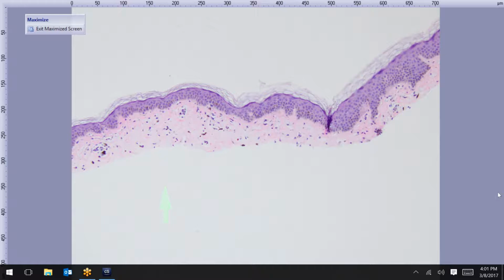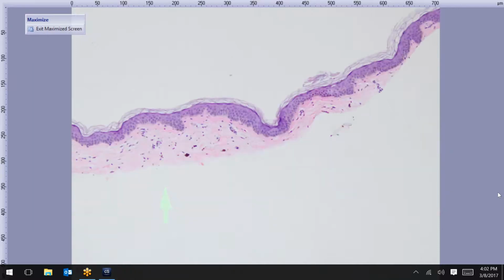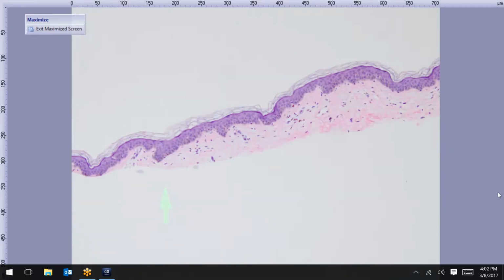Yeah, that's correct too. So you can sometimes get just a touch of interface change with erythema dyschromicum perstans, but by the time we get the biopsies, the rash has aged to some extent, and you get this picture. So good, that was great. And I think they did a second biopsy on that patient, similar and the same, erythema dyschromicum perstans.